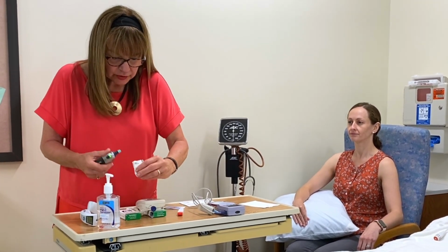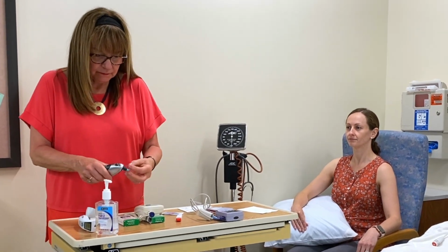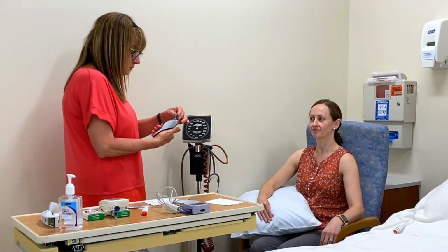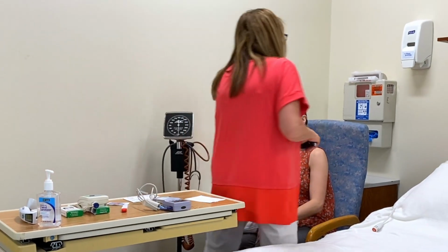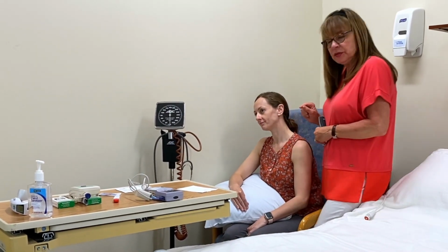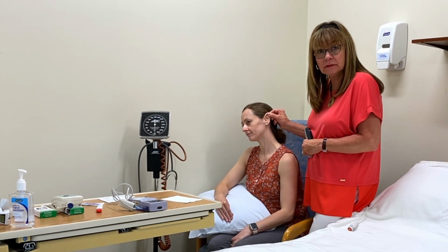Oops, I wonder. Okay, so you have to turn it on. And then what you're going to do is, in order to straighten out the auditory canal, you have to, on an adult, pull up and back.